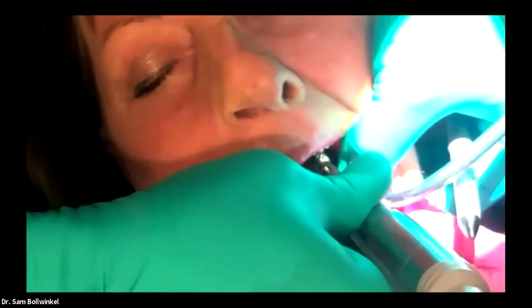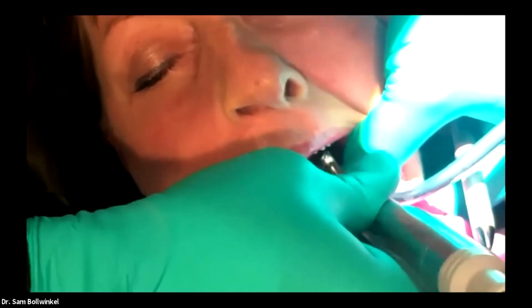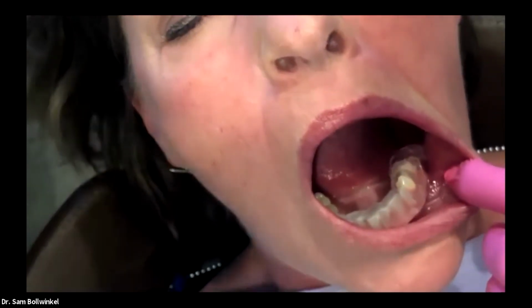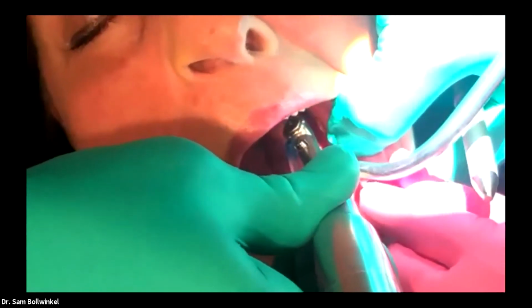Perfect. Okay. So we're going to do our osteotomy here. Good. And that sleeve comes right out with the osteotomy drill. Each drill has its own sleeve, so that as we gear up and go through this, we'll just make sure our sleeve gets down fully seated in our guide. Good.